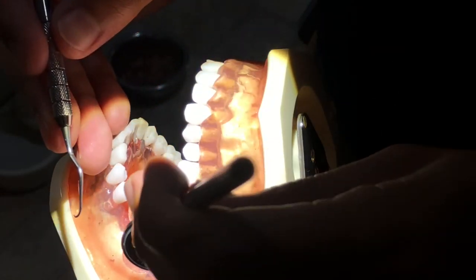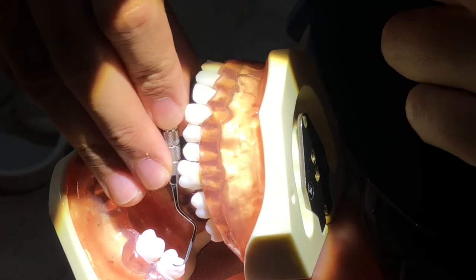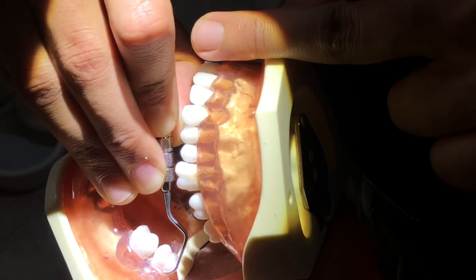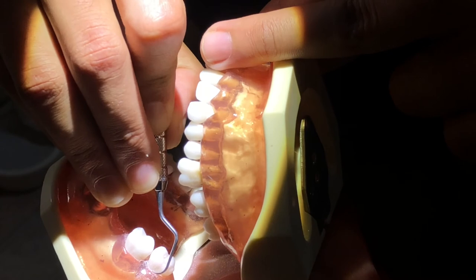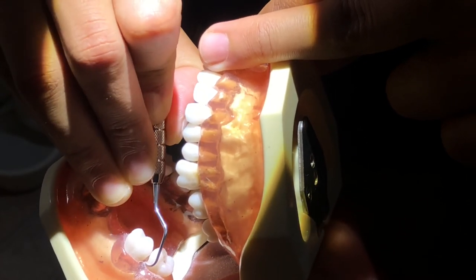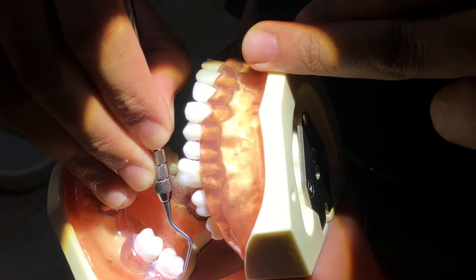Using a Gracey 7-8, I'll be instrumenting the buccal of number 17. I put my mirror here for retraction and indirect vision. And then I'll insert, open the blade and activate. Reinsert in the distal.